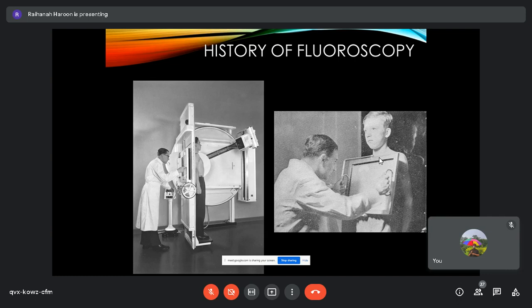how the picture should look. They must know all that. So there will be a pedal beside the operator and he will press it. There's a pedal for the acquire or capture button, which will produce an X-ray image, a high dose image. And there'll be another pedal which is for screening. Screening is a low dose. It will give off a low dose.